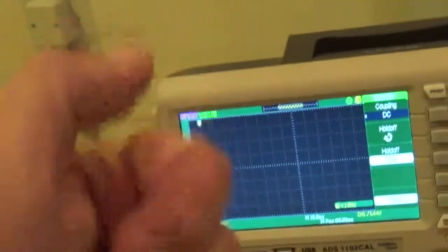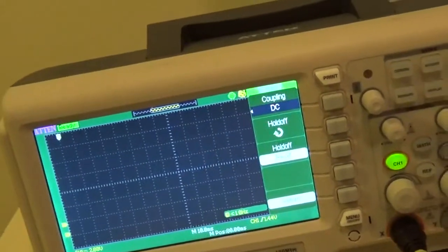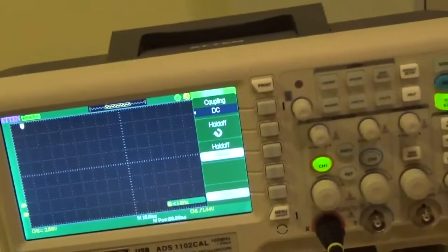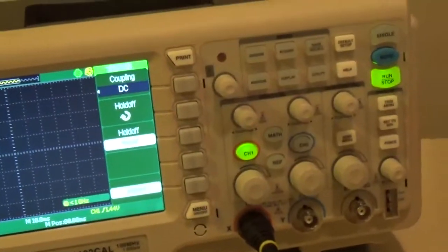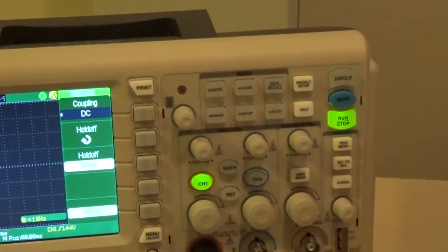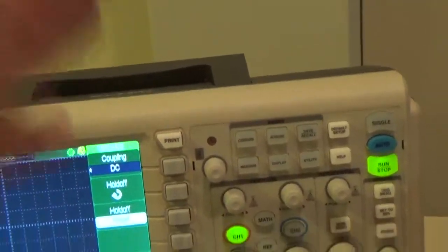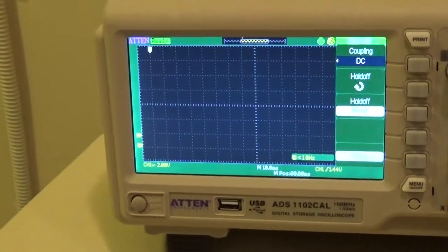What will happen is you'll hit prep and the scope triggers on prep because it picks up the noise from your rotor circuit. Then you hit expose and it triggers again, wipes that noise out, and puts up the waveform you're looking for. Then when the relay drops out from the safety contactor, it triggers a third time and wipes out your signal again. Noise reject will get rid of it. There is no rule for high frequency; you don't know if it's HF or LF that's false triggering. You just try it. If it doesn't work, you try HF, and if it still triggers falsely, try LF reject. So that's what those are for.